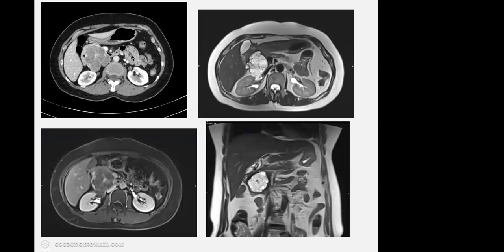The volume data are acquired if the CT scanner is having rows of detectors, 16 slice or more, where we get data of sub-millimeter thickness. We take the data from the whole body, and the slice thickness would be less than a millimeter.